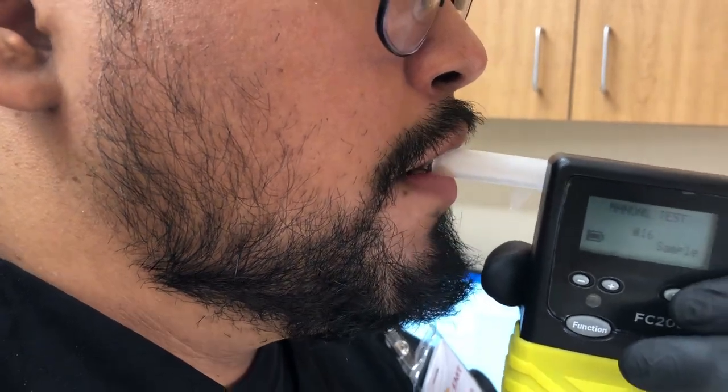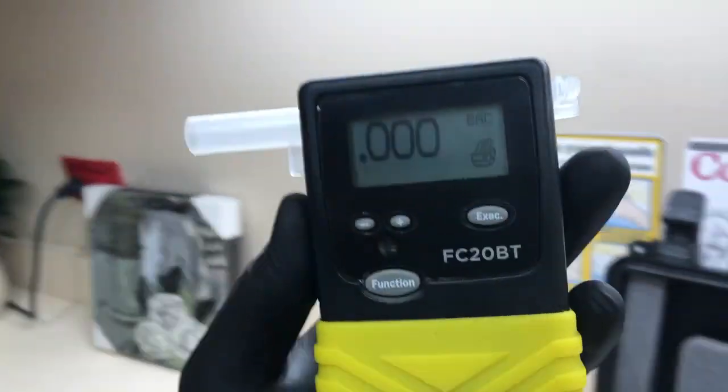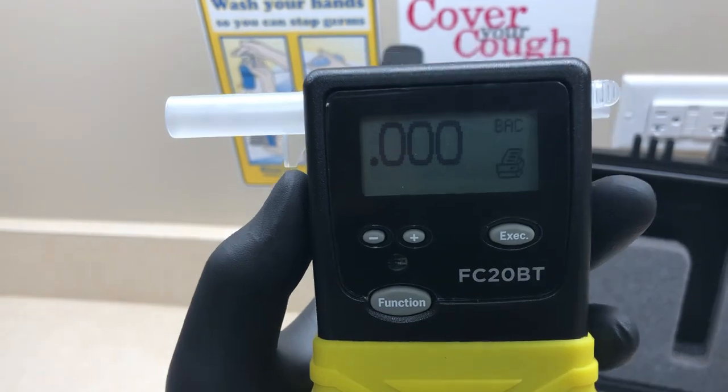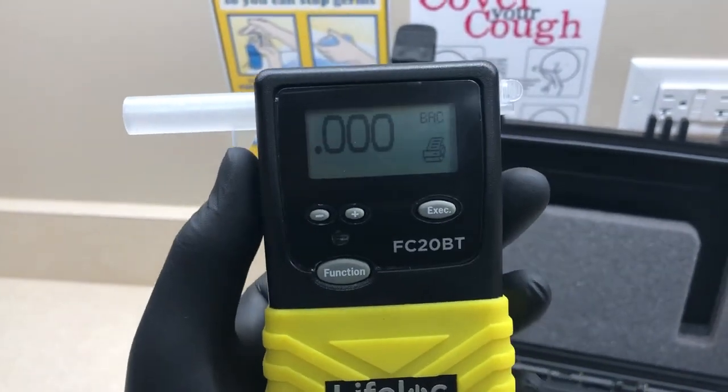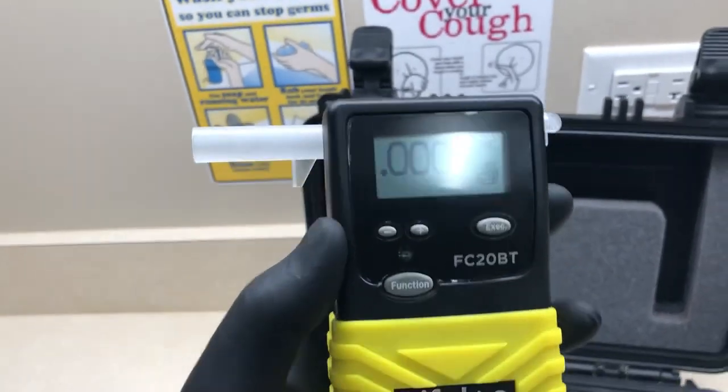And it still results in a blood alcohol concentration, even if I didn't want to give a full breath. So this could be for the patients, like I said, that are not compliant, or are kind of out of it. I'll let you be the judge of that.